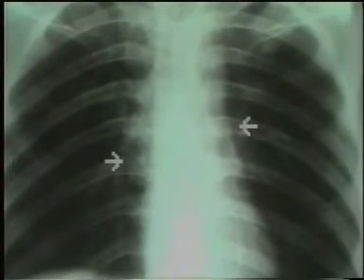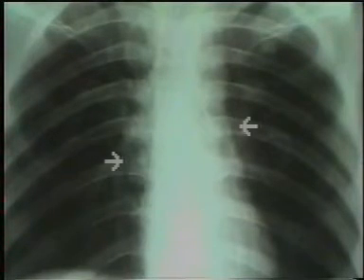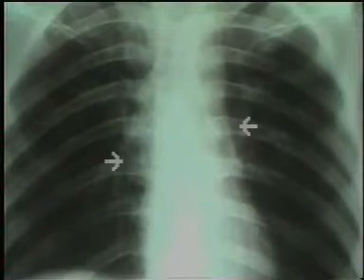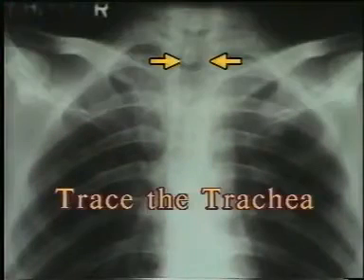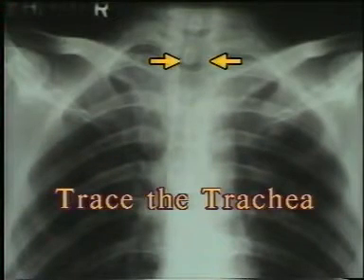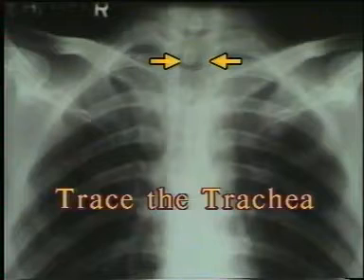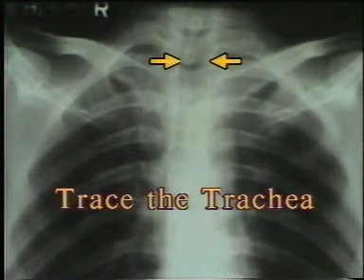Then study the hila, represented by the shadows of the hilar vessels. The left hilum is normally at a slightly higher level than the right. Lastly, identify the course of the trachea up to the carina for any deviation.